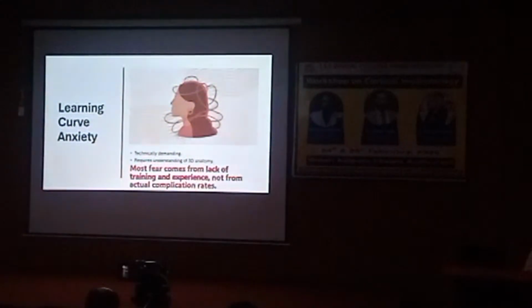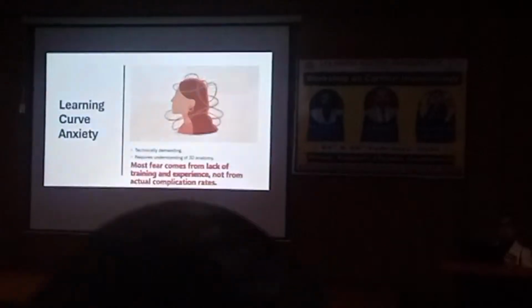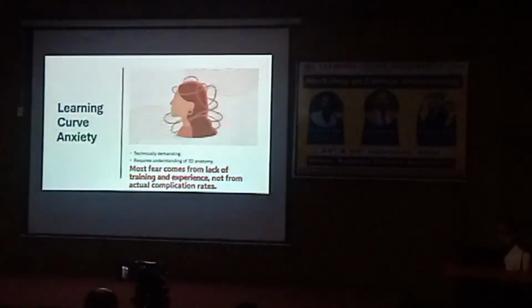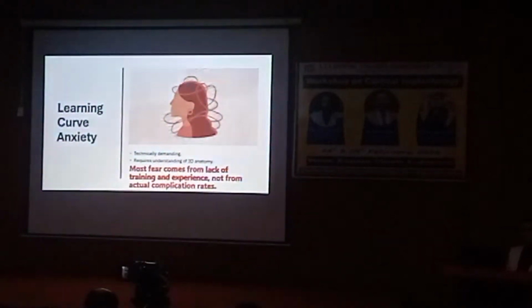We don't want to expand our area of working. But with the FX 1-2 technique, because it is a flapless and minimally invasive technique, we will be able to restore all full mouth cases without any surgery. But yes, pterygoid is technically demanding. It requires 3D understanding of the anatomy. We read the anatomy in the first year of BDS, but we need to understand it in 3D.